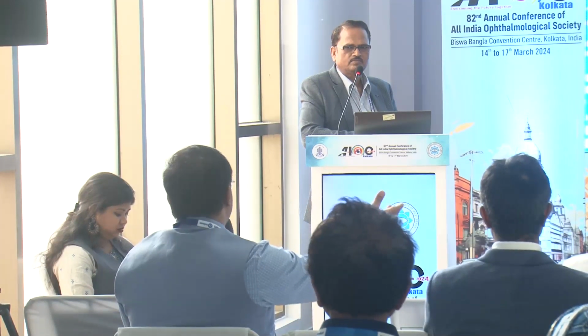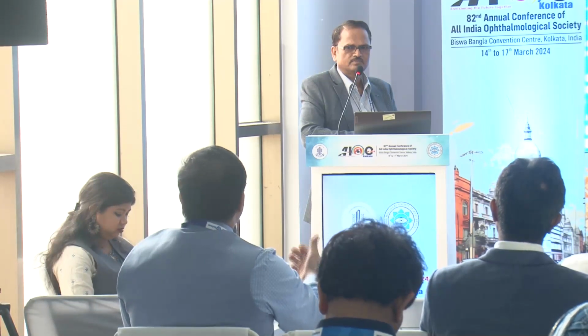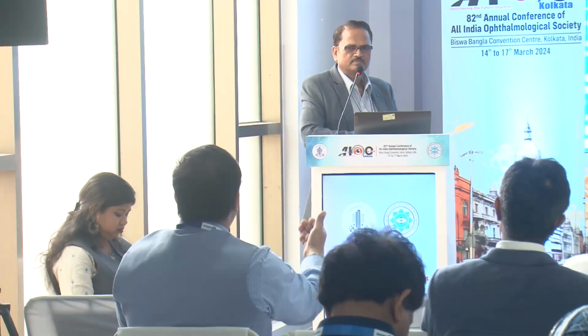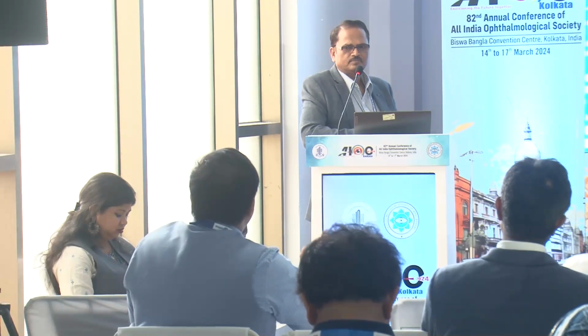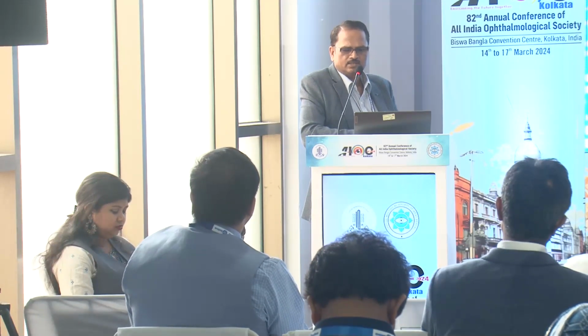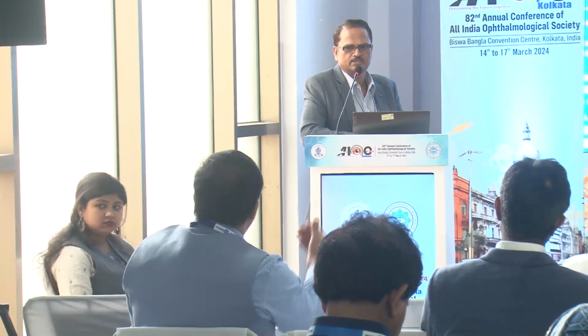Just like Dr. Ellen said right now, what do you do in your practice to ensure that even though you are giving an EDOF lens, the patient somewhere at least gets N8 or N6 partial? Most of the patients with EDOF require some amount of near correction. How much addition do you do in your biometric calculation, so that even though the patient compromises 6/6, it may become 6/9 partial? No, in biometric or after surgery.